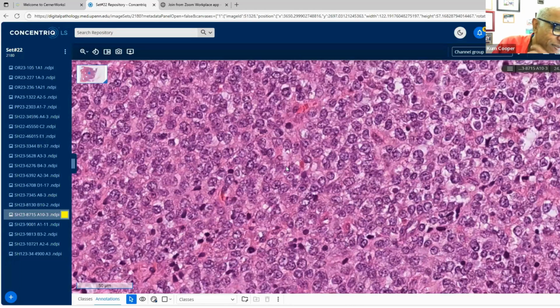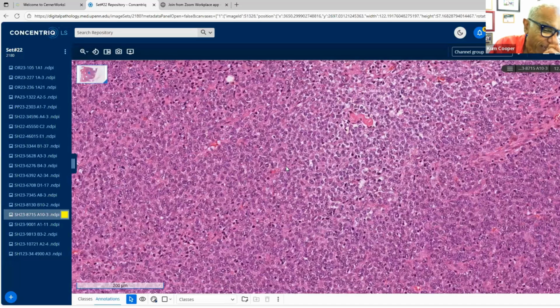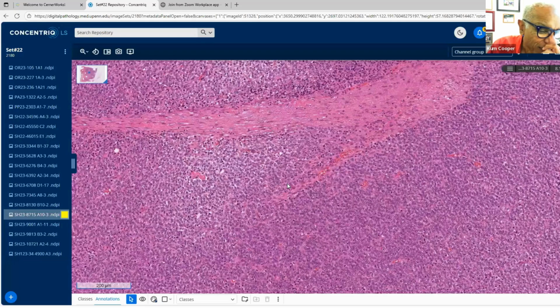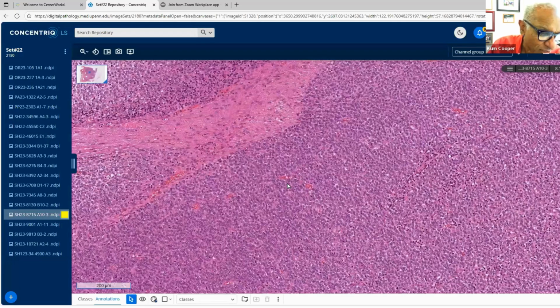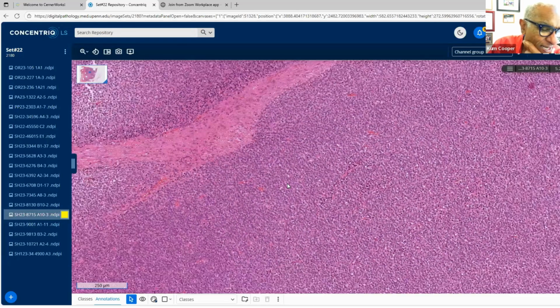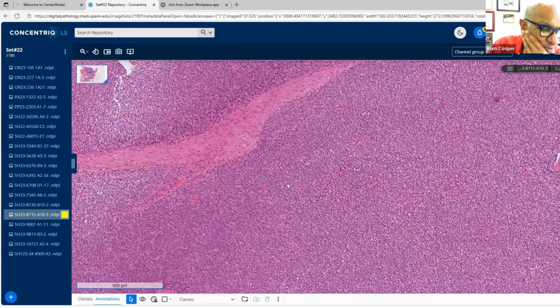DDIF SFT, that's a good thought. That's a very good thought. They can have round cells. So here's, there's a nice paper actually. I think it was September, AJSP, my good late friend Dr. Fletcher is on that paper.